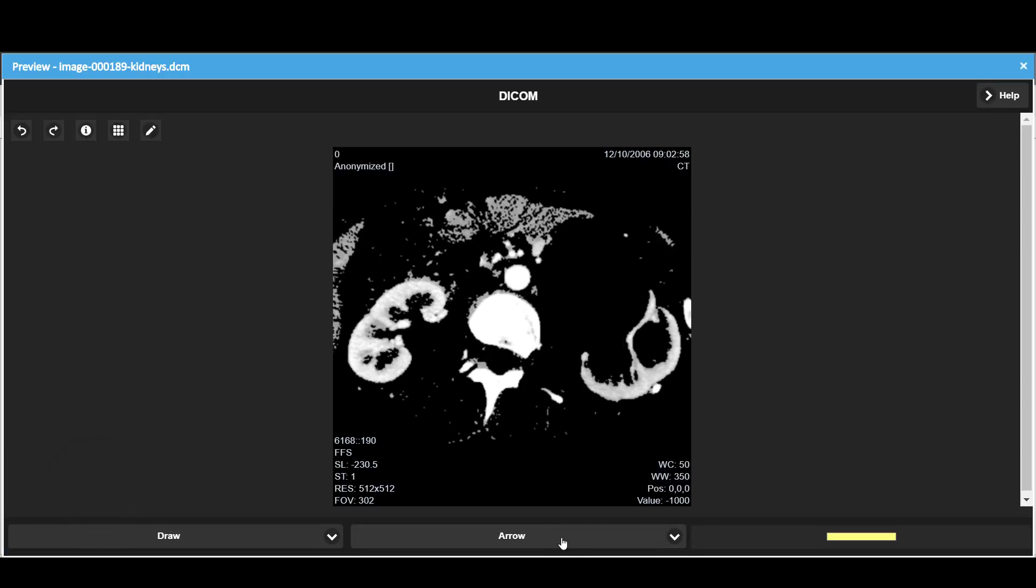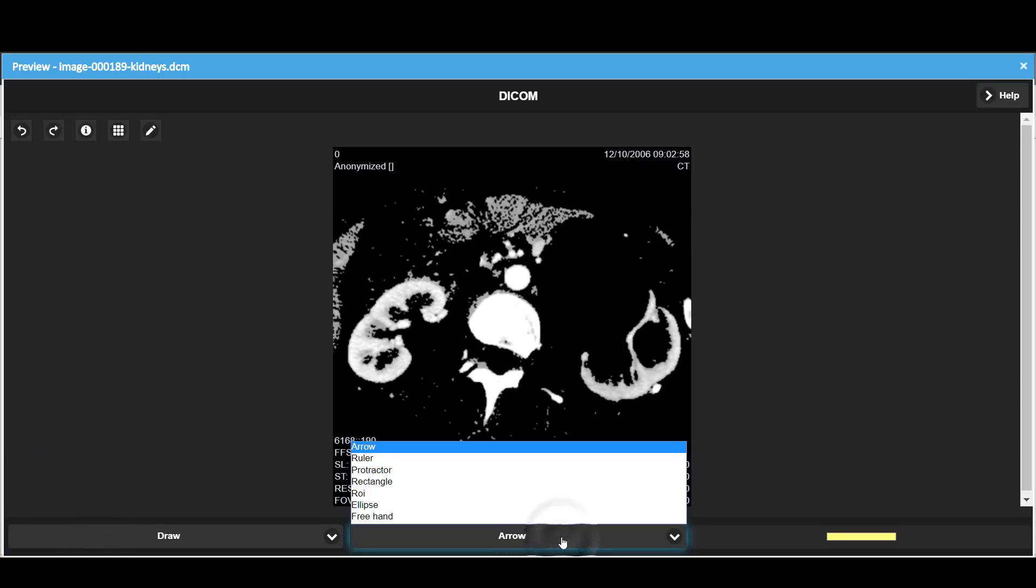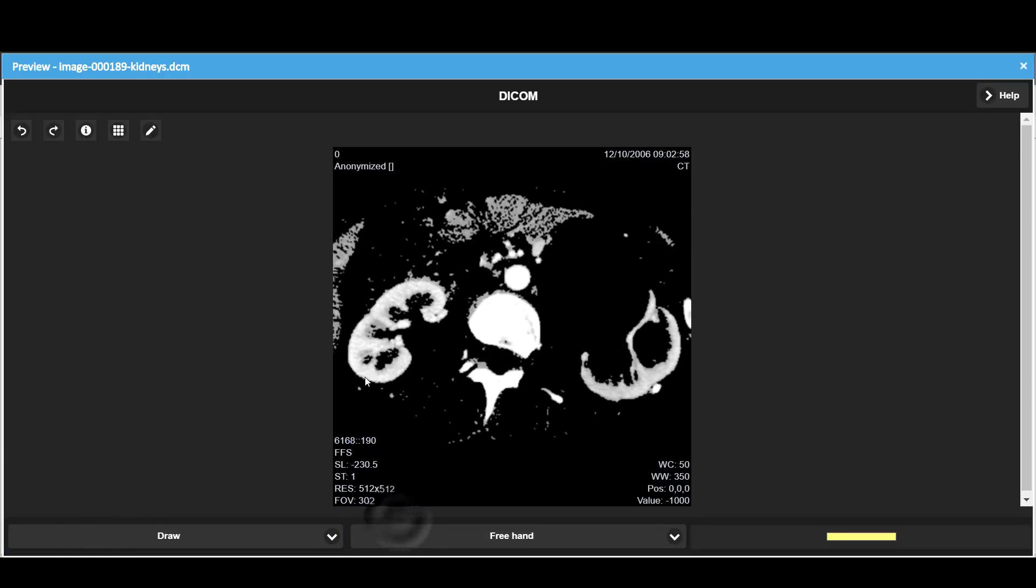Here, we use the freehand drawing to draw an outline.